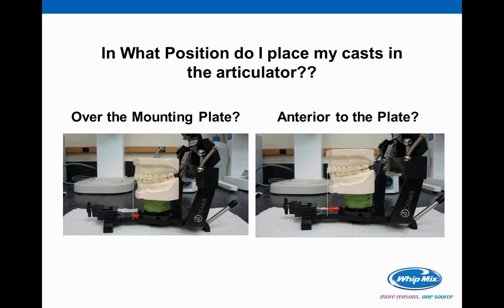The first question we're always asked is, what position do I place my casts in the articulator? Now you'll notice, do we put them right over the mounting plate? We actually have phone calls where folks call and say, this just isn't right, it's not centered over the mounting plate.